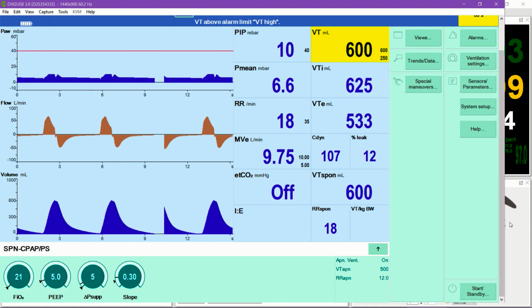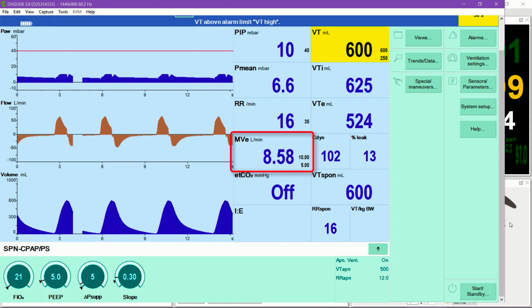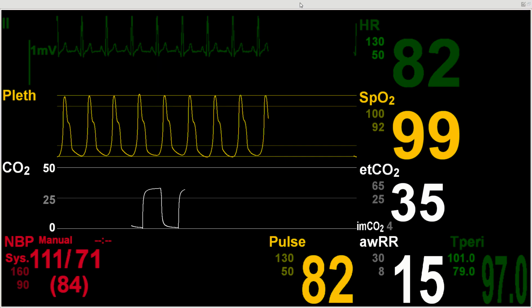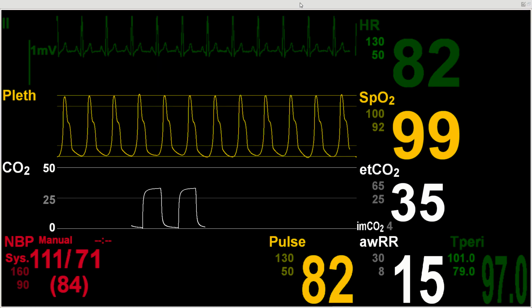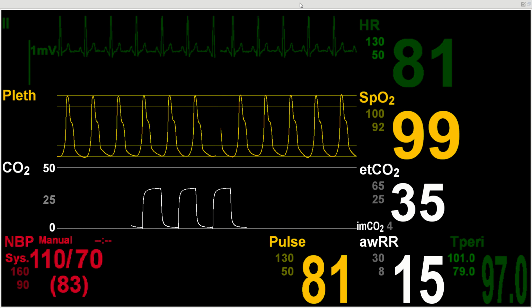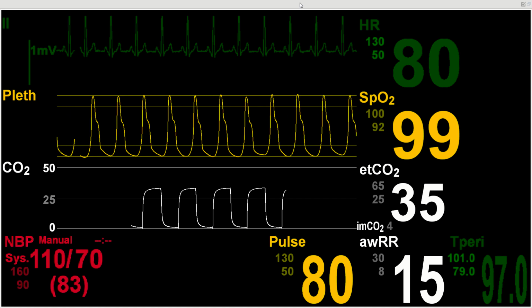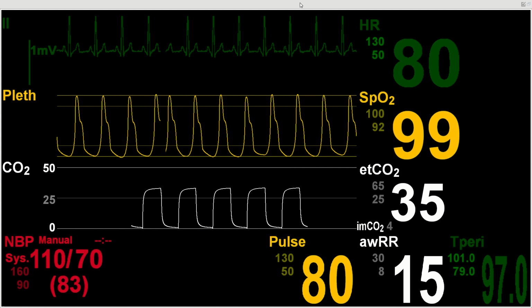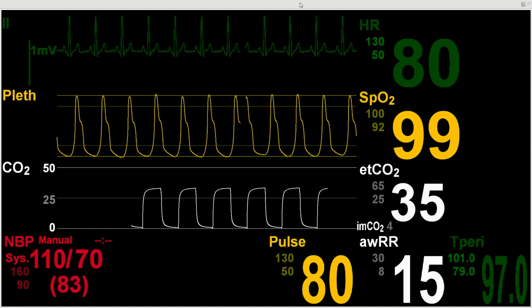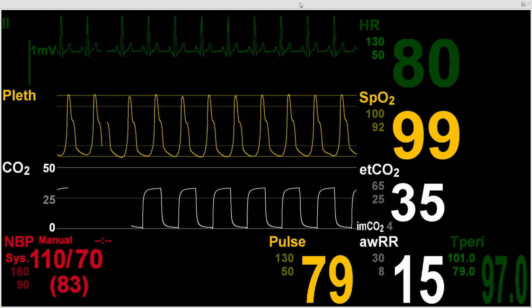As the patient's effort and rate continue to trend down, the learner should observe that the minute ventilation is trending down toward a normal value as well. With the activation of this new state, we have automatically applied a new set of values that will be displayed for the learner on the patient monitor. Now, the patient's vital signs and the ventilator data should both be clear indications that the patient is more comfortable. After approximately 20 minutes on these settings, the learner should conclude that it is time to extubate the patient.